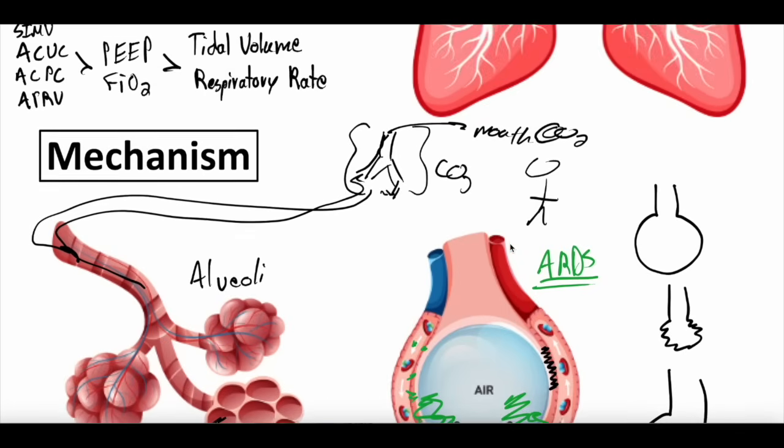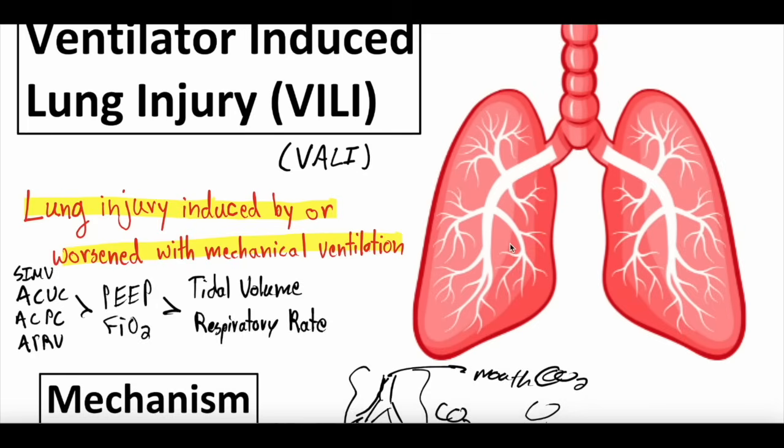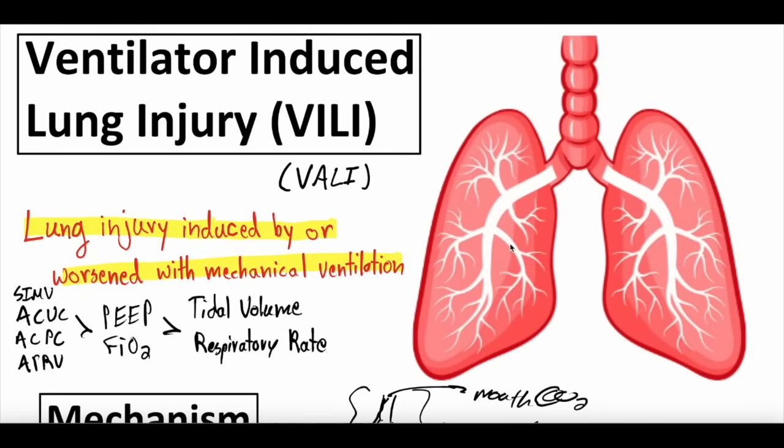And if we use those strategies, hopefully we can bridge people, get them the treatments they need, and then get them off the ventilator as quickly as possible, because we never like to leave anyone on a ventilator longer than their lungs are absolutely demanding.